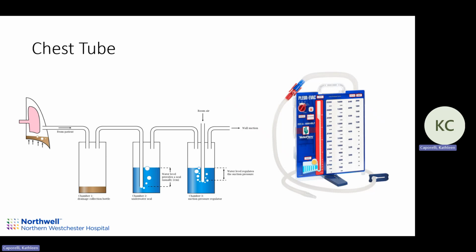Especially if the fluid level's up here and you think you see a bubble here, a lot of times it's not actually an air leak. Does that make sense? Okay. And who has a big tidal swing or ripple? It usually has to do with how much space is left. So if patients have more space, usually there's more of that change in pressure, and you'll see that.